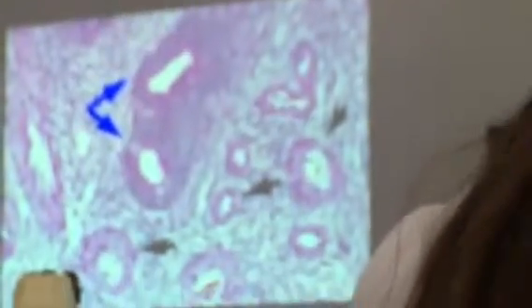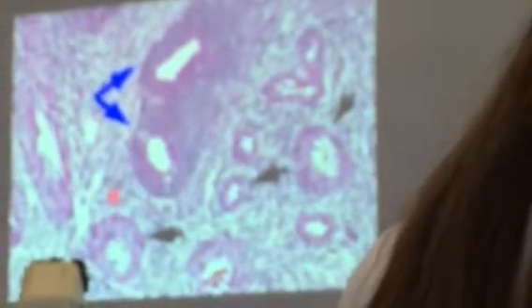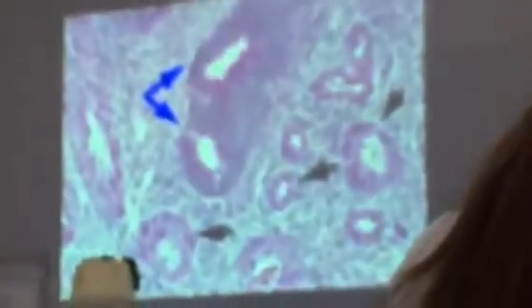Yan. Okay, and then the stroma of the polyp is no longer endometrial, it's fibrous. How do you know it's fibrous? It's because the shape of the nuclei are now more elongated. And it has the quality of being fibrous now.